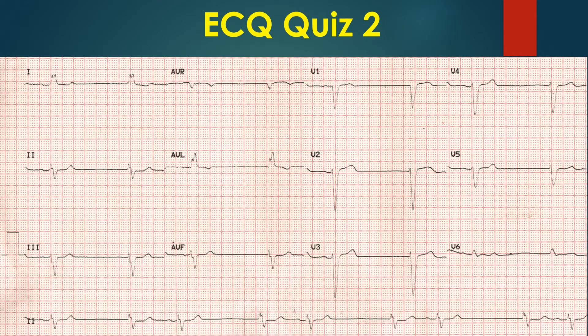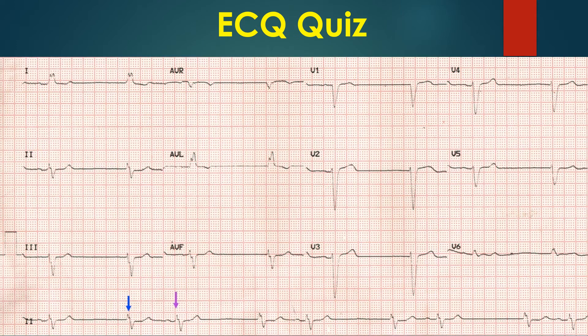What are the salient features on the ECG? What is the mechanism? Lead 1 and AVL show wide QRS complexes suggestive of left bundle branch block. PR interval for the sinus beat is 200 ms, at the upper limit.